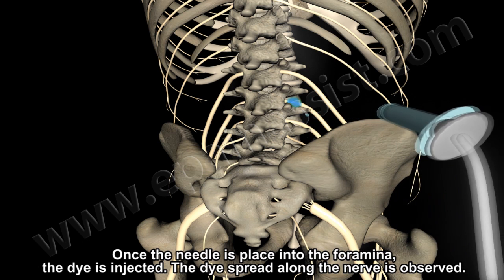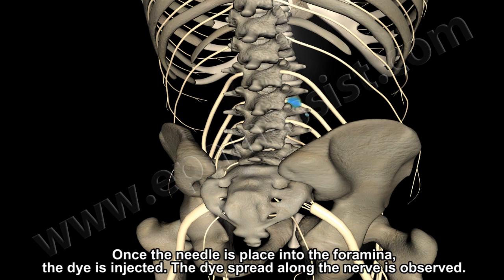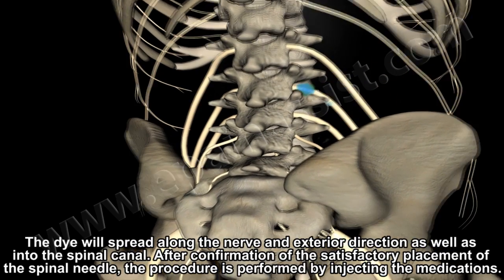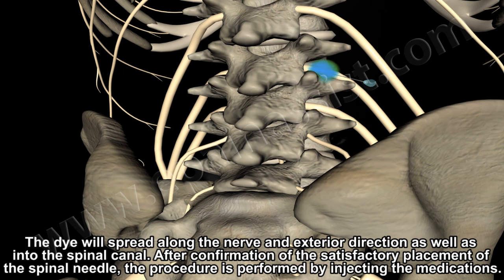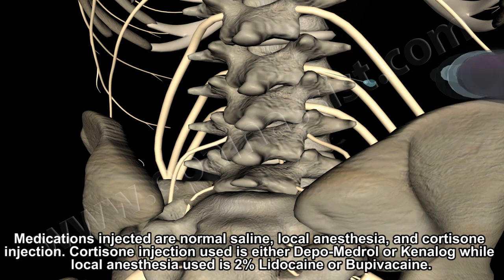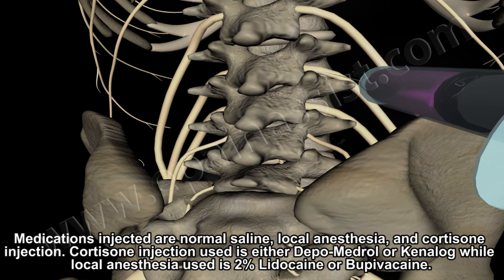Once the needle is placed into the foramina, dye is injected. The spread of the dye along the nerve is observed. The dye will spread along the nerve in an exterior direction as well as into the spinal canal. After confirmation of satisfactory placement of the needle, the procedure is performed by injecting the medications. Medications injected include normal saline, local anesthesia, and cortisone.